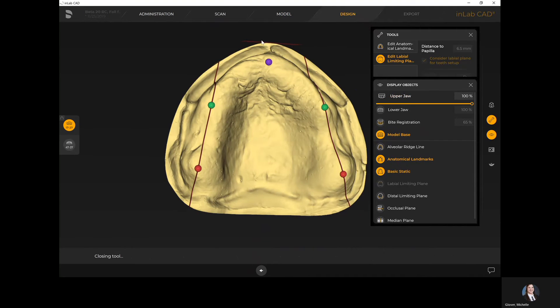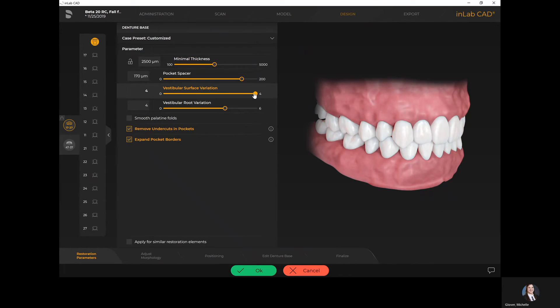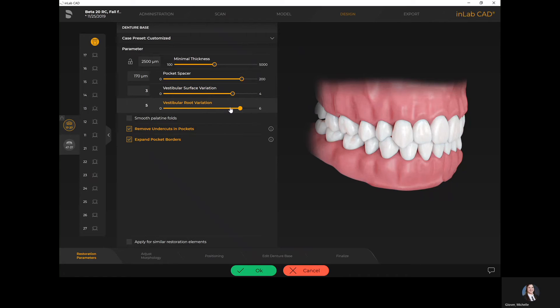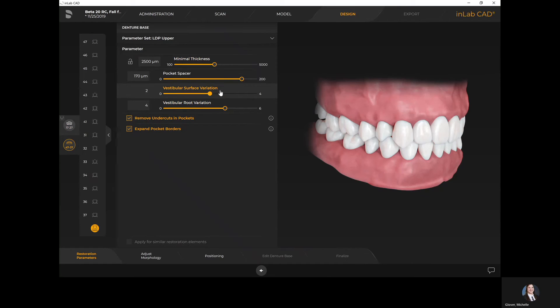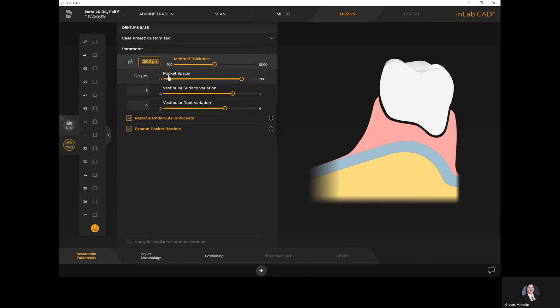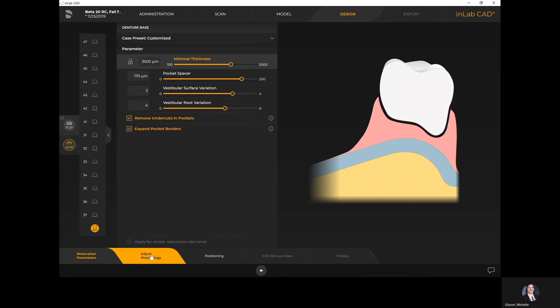We've completed all the steps in the model phase and are now in the design phase. The first step is always the parameters. You can set as many parameters as you want based on the materials you're working with. You can determine how much texture you want in the vestibular area, how much root variation to mimic festooning, or keep it smooth. You can have the software automatically propose smooth or highly detailed vestibular festooning. For the upper jaw you also have the option of a smooth palate or one that follows the rugae. It's important to note what the manufacturer recommends.